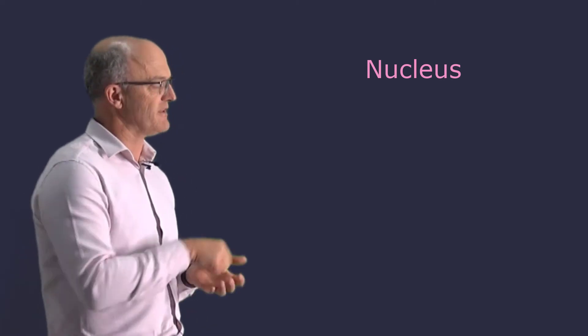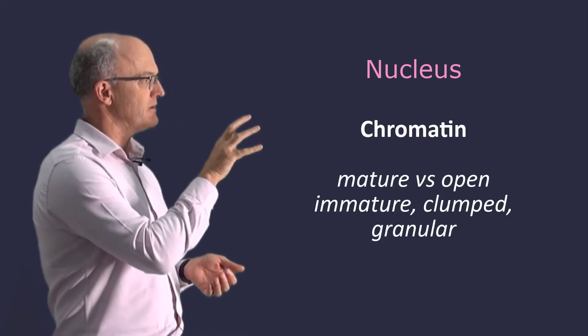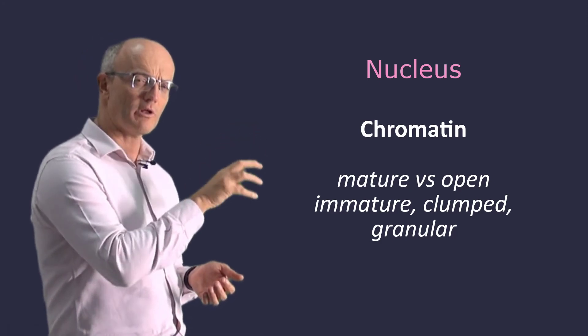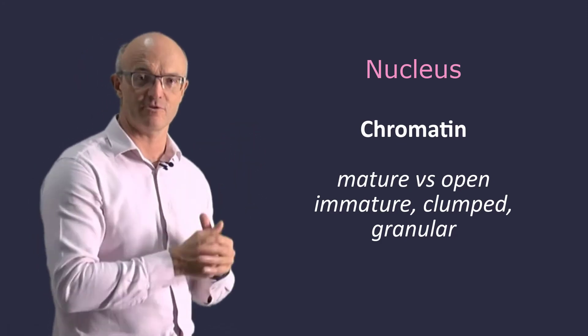Then focus on the nucleus. In fact, this is critical, particularly when it comes to blasts. So, the first thing to look at is the nuclear chromatin. Is it open, fine, uncondensed or closed, coarse, condensed nuclear chromatin?